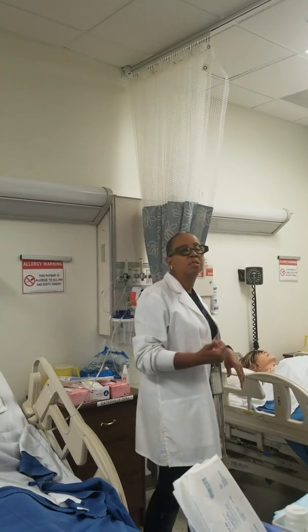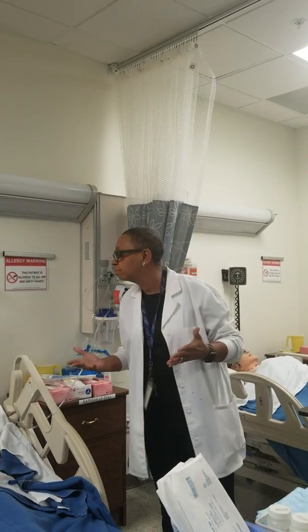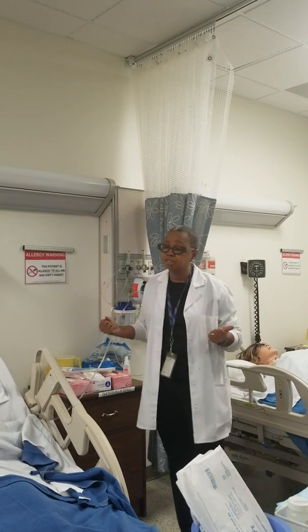Okay? What else? Sputum coming out of his trach. Any sputum coming out. All this is your assessment. What else? Check if there's any obstruction. So if there's any obstruction, okay?